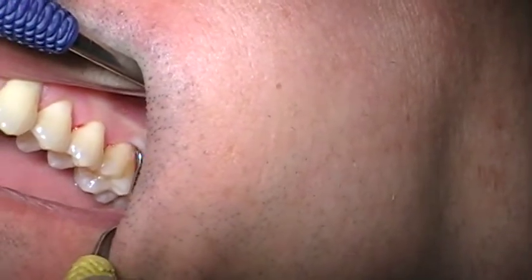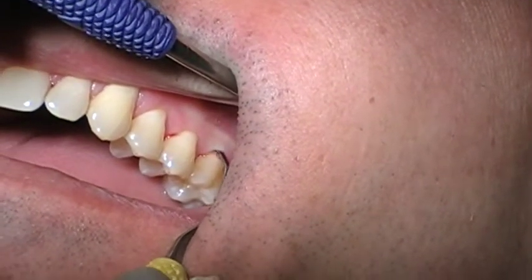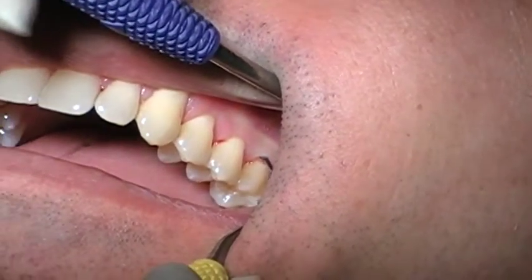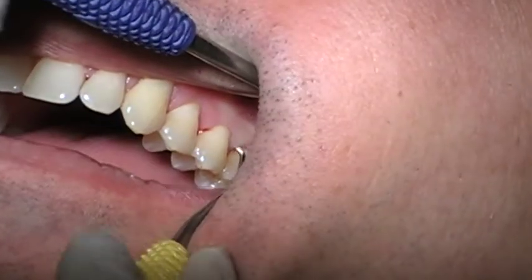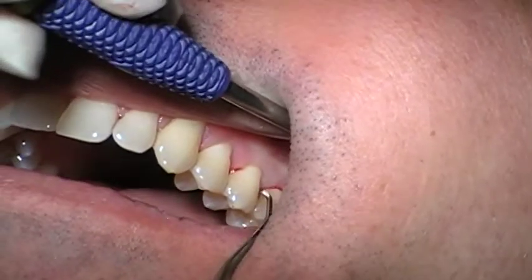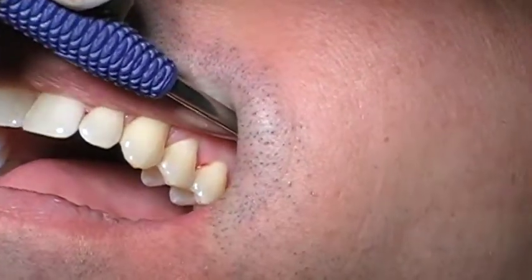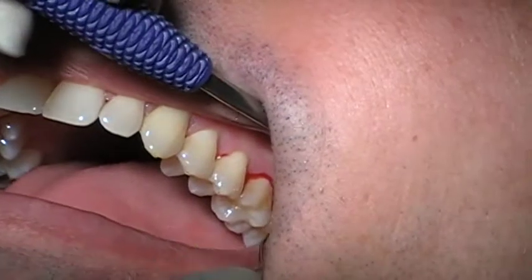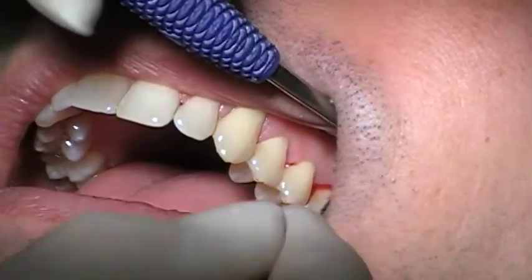As I come at the mesial line angle, I'm going to turn and keep that toe adapted and roll it into the mesial. You can see a little bit of calculus came off, and I'll go to the next two.